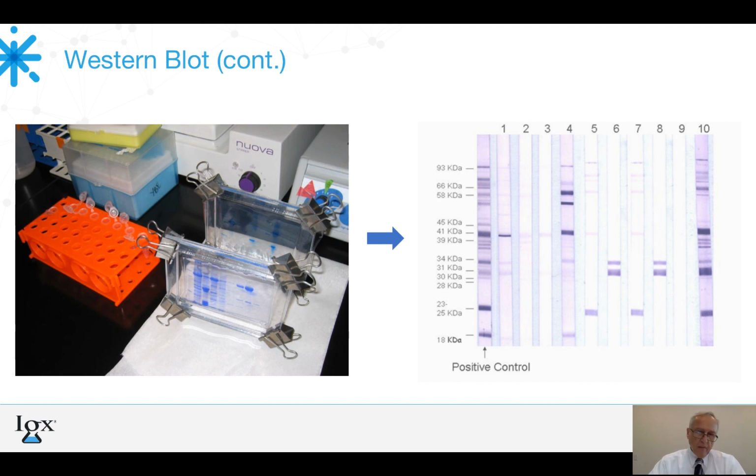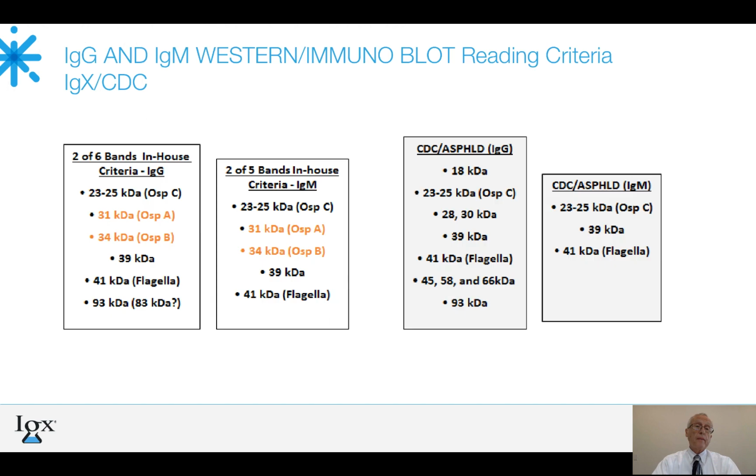the blot. When they form that immune complex, you transfer it over to that piece of paper on the right so that it doesn't move, and now you can read it through a scope or through other means, and you will see the specific bands related to, hopefully, the disease you're looking for among all the bands that are there.